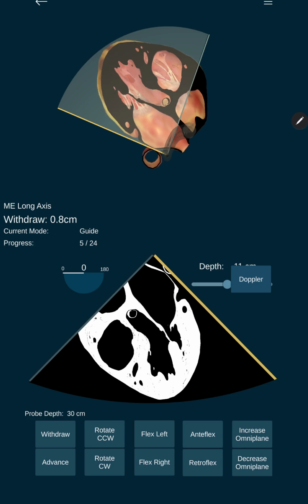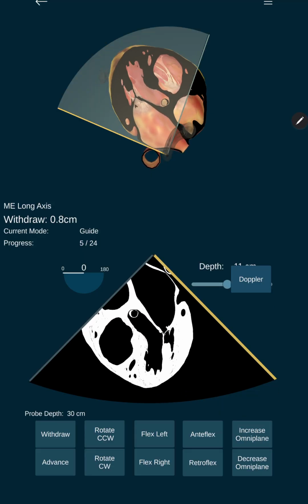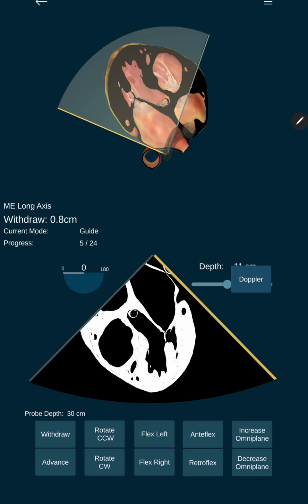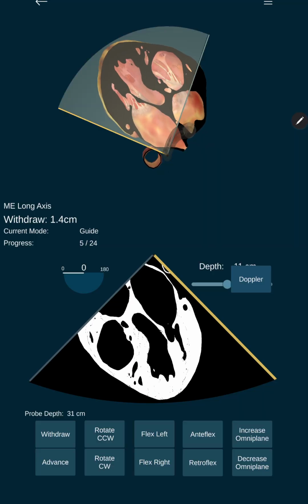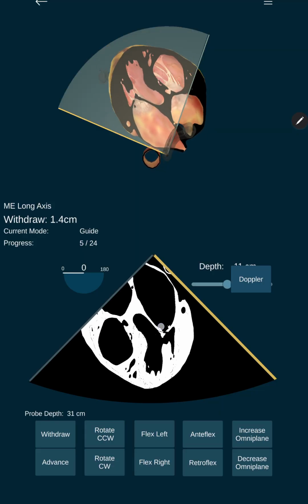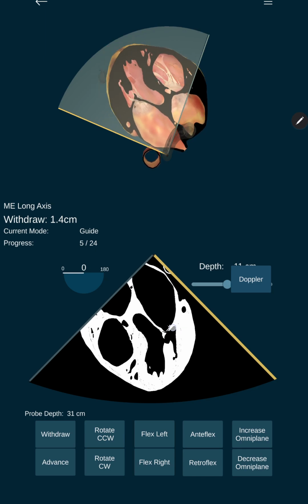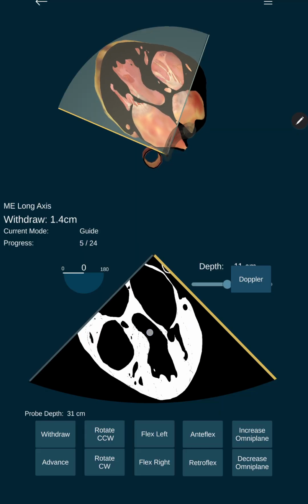the A1 and P1 segments. So this is the posterior mitral leaflet and the anterior mitral leaflet. The A1 segment and P1 segment of the mitral leaflet are more commonly well defined in the 5-chamber view. Further advancing, we can get the mitral leaflets, AML and PML, at the LVOT level. So that is the A2 segment of the AML and P2 segment of the PML, well defined where the LVOT is there.